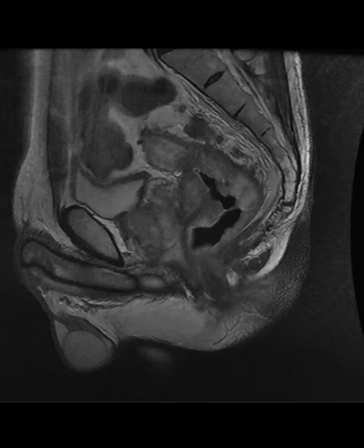Oh, gotcha. Yeah, because tumors can do whatever they want. So I bet if you pulled 100 rectal cancers, I don't know if heterogeneous will just equate to this is going to be MSS, this is going to be MSI. Then we don't need pathologists, to be honest. Right, exactly. That abdominal radiology paper looking at radiogenomics, I think that's more academic. Clinically, I think it would be very hard to say that. Qualitatively, like that image that I showed you, what they saw as heterogeneous looked a little bit more homogeneous to me. So this is where we love our pathologists.